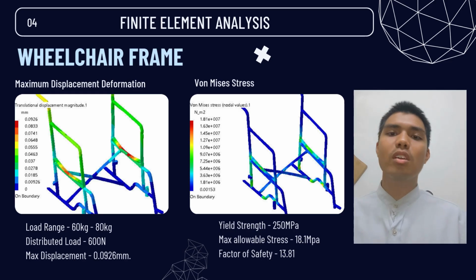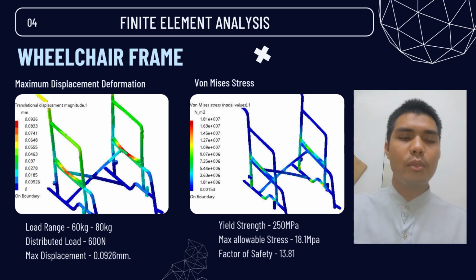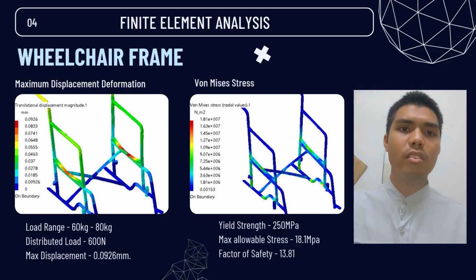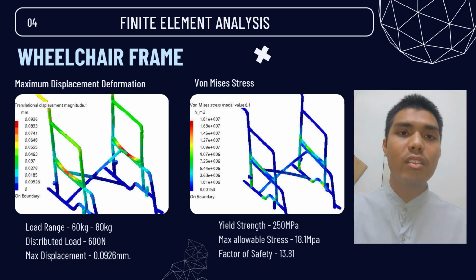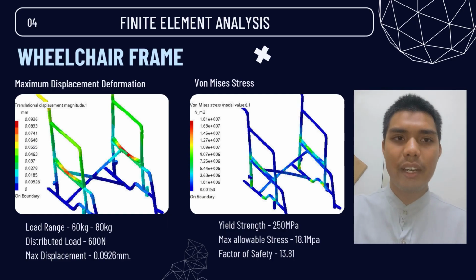So we choose 600 Newton, which is the average weight of a person of 60 to 80 kilograms. So we can see here the maximum displacement of the section parts is 0.0926 millimeter. Therefore, the steel frame will not fail upon the load that has been assigned on the section part.